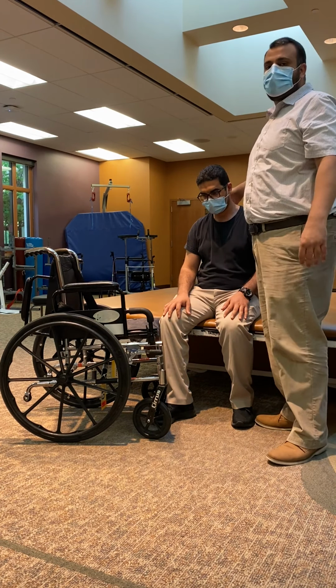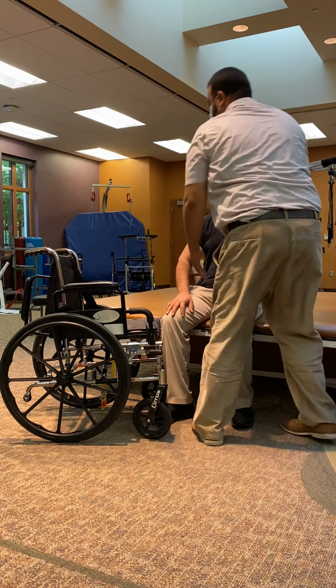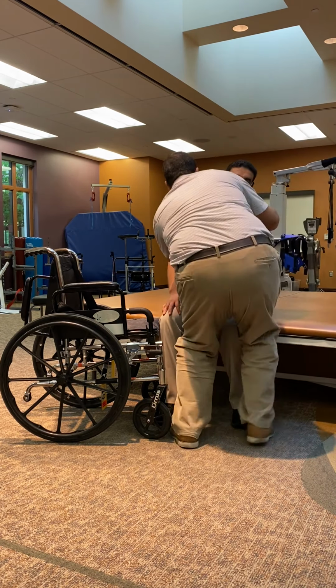Add to that, to make the transfer easy and facilitate transfer, we have to start with the right position by bringing the side of the bottom forward. Which side? The side that the patient is transferring to. So I have to bring the right side forward. To do that, I can just put one hand, as I said, on the left upper side, and the other hand on the right bottom area. I'm going to ask the patient to lean toward your left side, please, and bring your right side forward. Great job. So now he is in the right place for transfer.